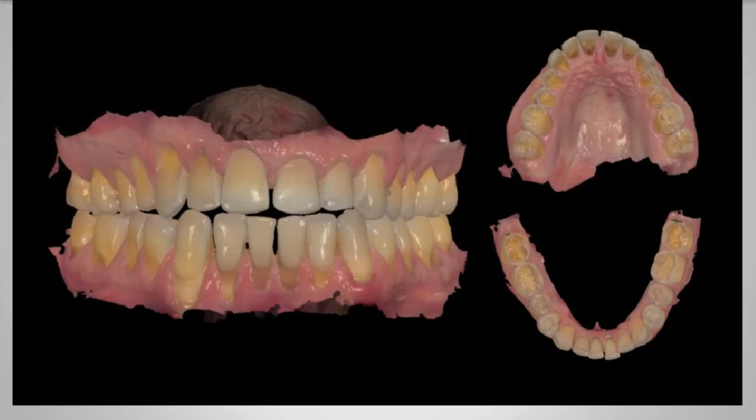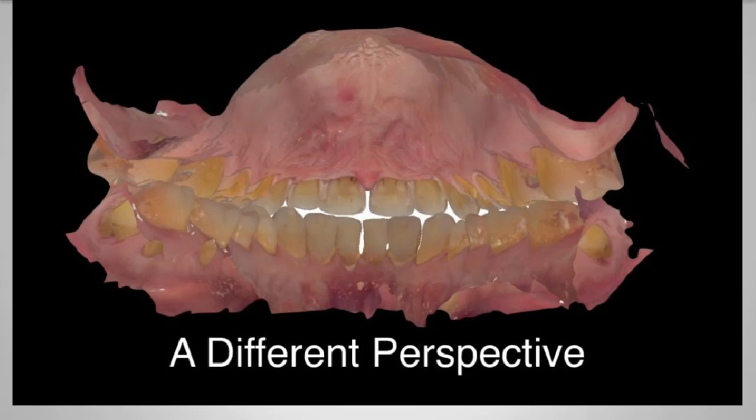What I was able to do is scan this patient's dentition of the maxilla and the mandible, digitally articulate these casts, and now show the patient from a palatal or lingual view what their dentition looks like. One of the complaints they had is they're not chewing as well as they once did. Well, if we look at this patient's case from the palatal view, we see that the palatal cusps are completely eroded. This is a completely different eye-opening moment for this patient, where with traditional model work, I may not have been able to do this with quite the same effect, because a yellow, blue, or white cast may not have the same results. But with the color rendition, this gave them a different perspective of their own mouth.